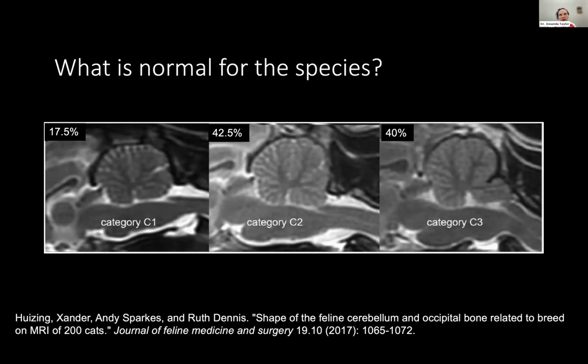So I do agree that it's probably somewhat case dependent, but I would say go back to that clinical question of, does it fit your neuroanatomical localization, and does it answer the question that you've brought to MRI to ask?